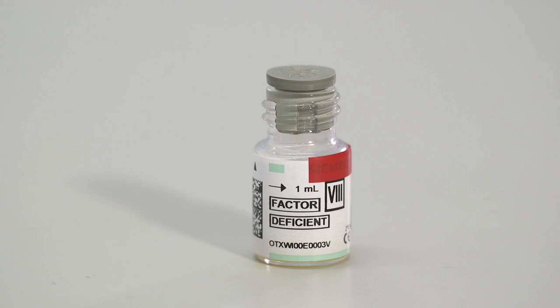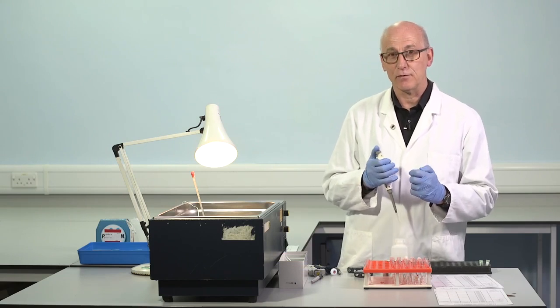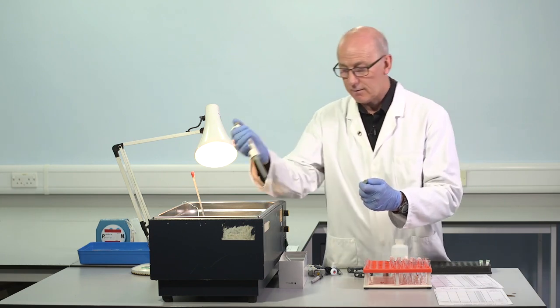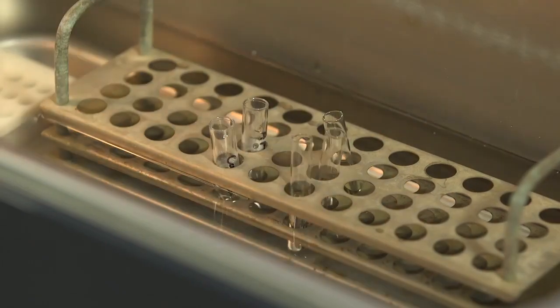So, factor VIII deficient plasma. It's really important that this contains von Willebrand factor. This can have an important effect on the results of factor VIII inhibitor testing. So for each of the 3 glass tubes, 100 microlitres factor VIII deficient plasma.